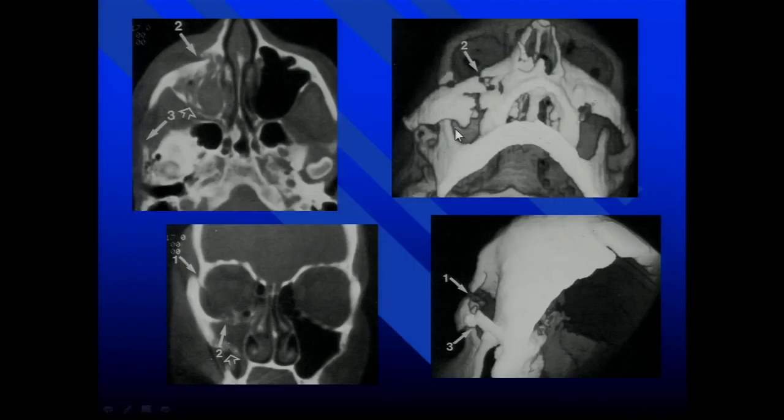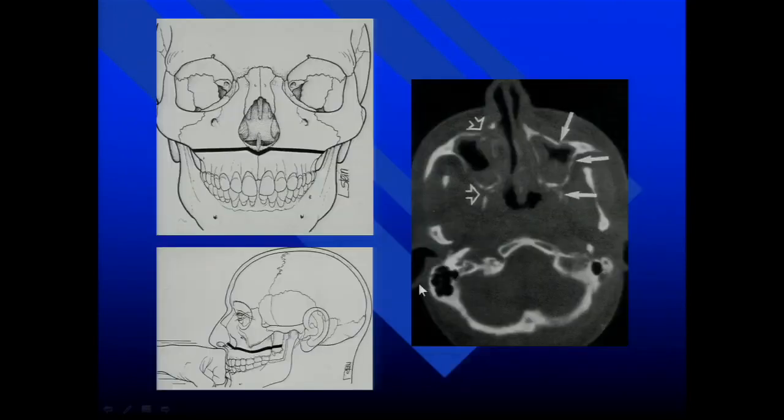tripod fracture. It's your inferior orbit, it's your anterior maxillary sinus, posterolateral maxillary sinus, and zygoma, which goes over the side of your face, of course. It can also involve the lateral orbit too, but not always, just may. But if you think about that, your high cheekbone, just think of the bones there, you'll remember all these bones. And here we go, anterior maxillary sinus, posterolateral maxillary sinus, lateral orbit, inferior orbit, and zygoma. You can see very nicely that high cheekbone displaced on the shaded surface display CT.